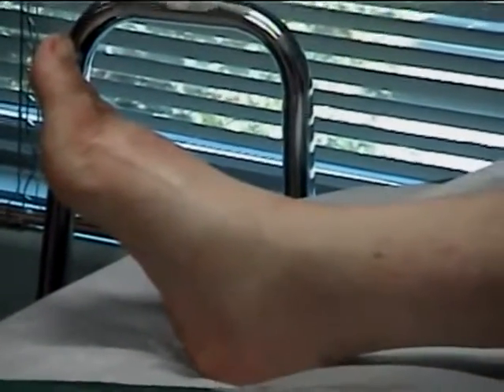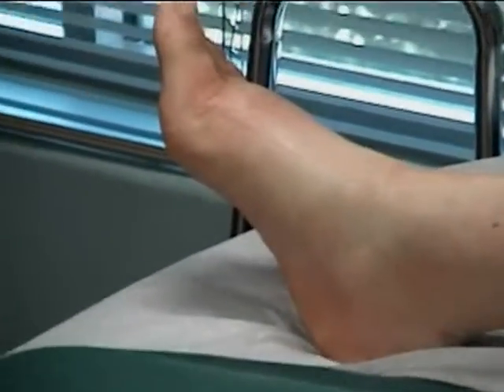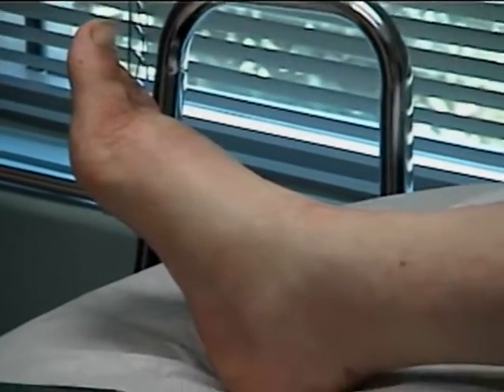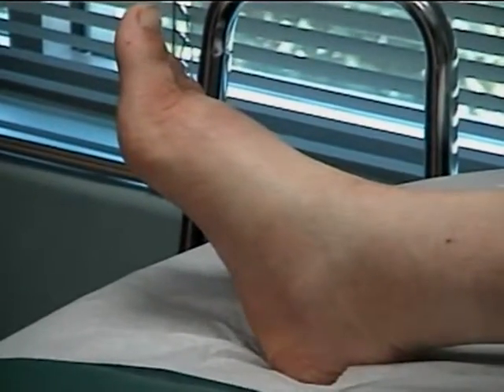We use alcohol because it evaporates really quick. I'm going to have Doc look at this one toe. I'm going to make an appointment with my GP.